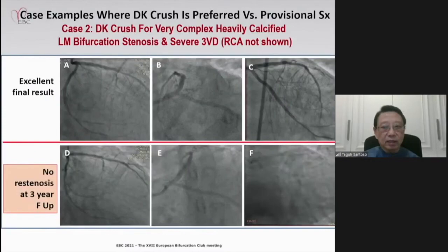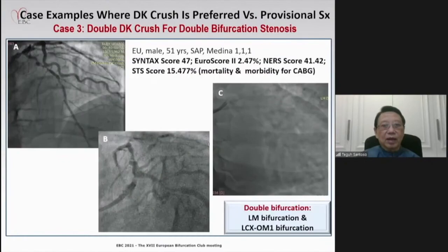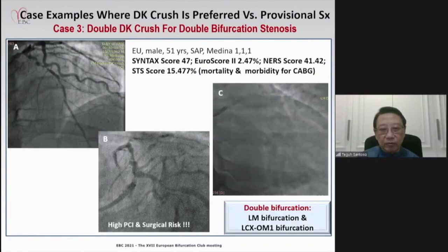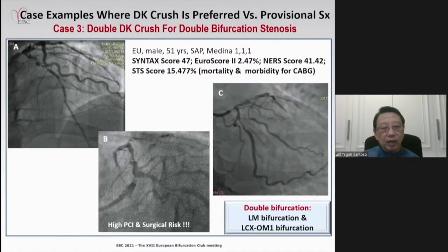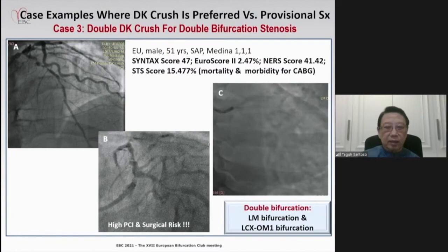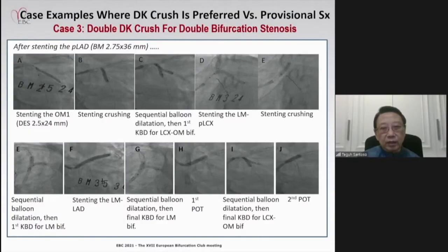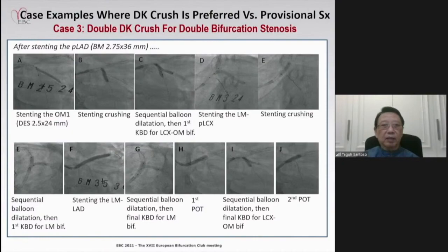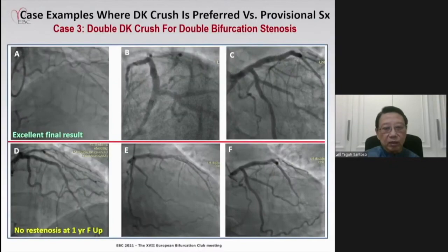Case 2: a very complex, heavily calcified left main bifurcation stenosis with triple-vessel disease, high PCI and surgical risk, diffuse disease in the LAD and LCx. After stenting the mid and proximal LAD and LCx, DK Crush was used to fix the bifurcation stenosis with an excellent result — no restenosis at three-year follow-up.